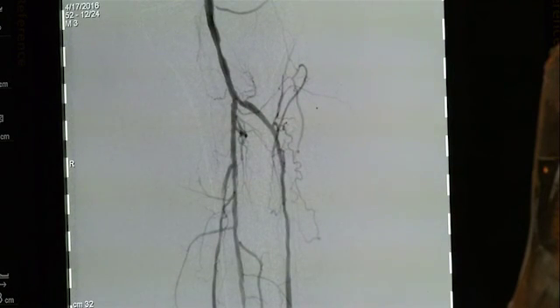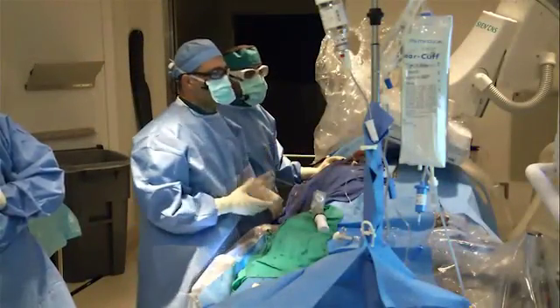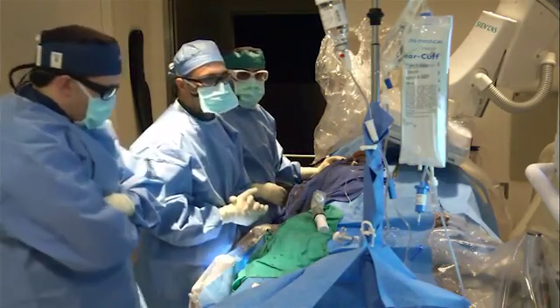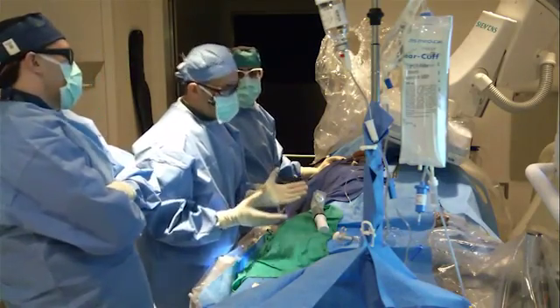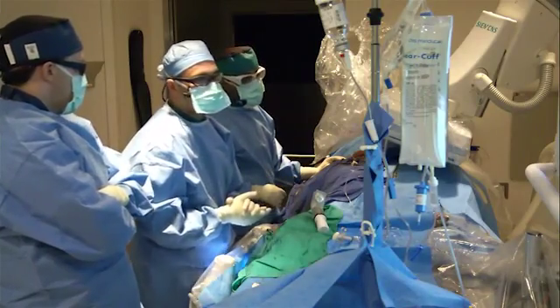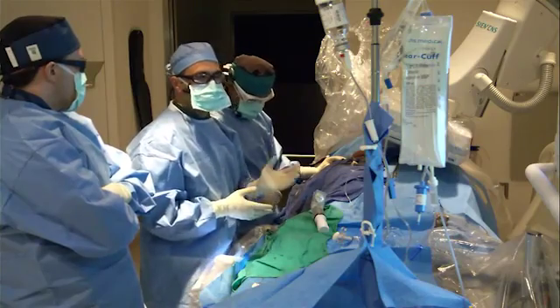If you have bad inflow, you're going to thrombose. So both inflow and outflow are important in my opinion. And in this situation, given that we posted the distal and it looks good, okay, you can go back. Looks good. We decided to hit the proximal, because the other option here is angioplasty that is now available.